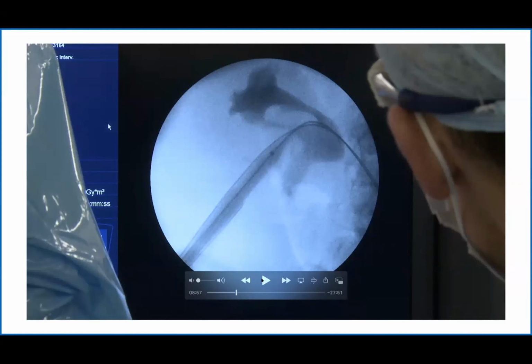Yeah, this isn't coned in, but often it is, and that's a point worthwhile making. It is normally pulsed, though I'm not sure if it is in this case. The other thing I'm not sure that we saw was the ultrasound access: the access at the beginning for the needle is controlled by ultrasound. There's little X-ray at the start, just really to check which calyx is being targeted, and then purely during the dilatation when you're using the balloon.